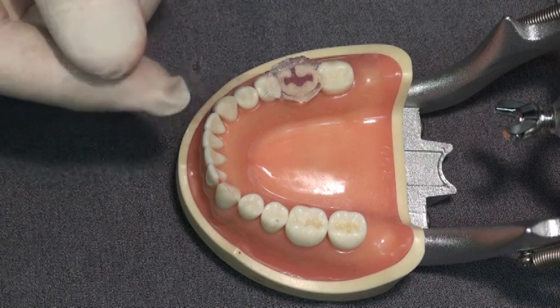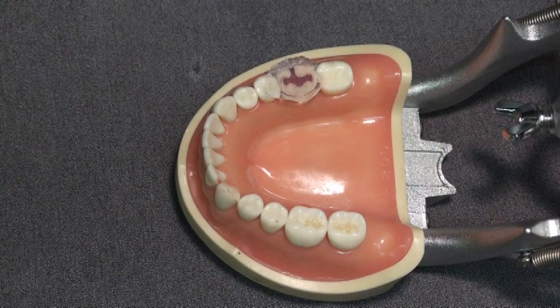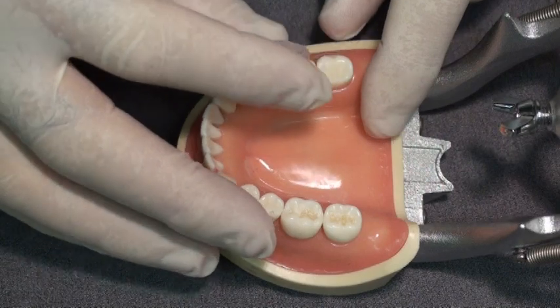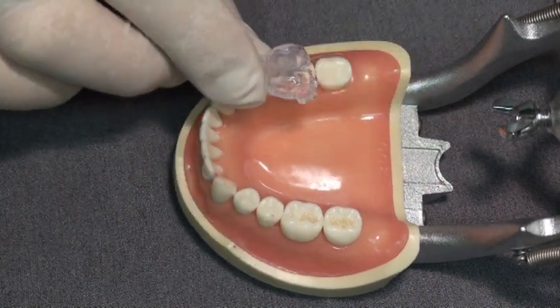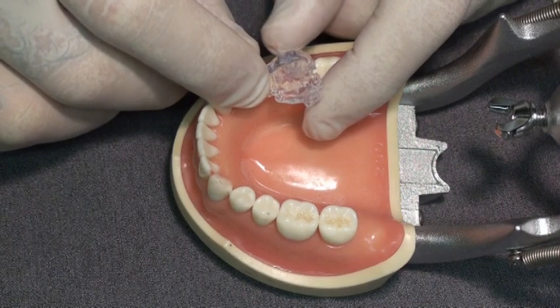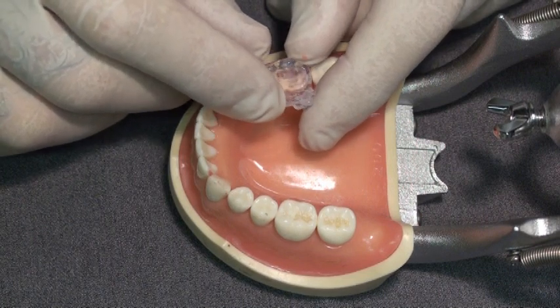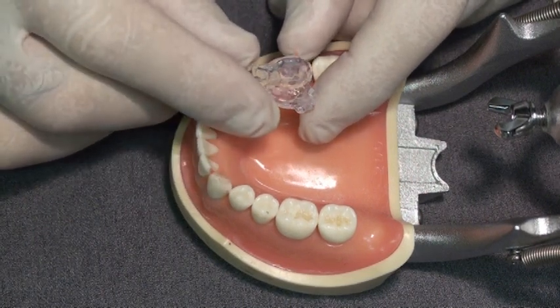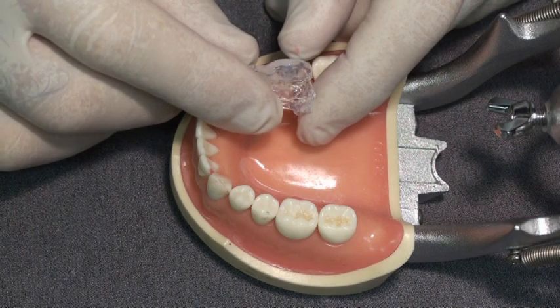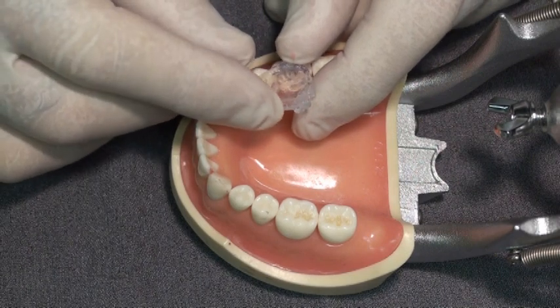The Mylar strip comes right off, leaving a very smooth, flat surface. The impression comes right off because it's just a polyvinyl siloxane impression. It's very hard to see the detail in something like this being a clear impression. But we'll use this clear impression to reform the unset composite later on in the procedure to create a surface that needs minimal shaping, finishing, polishing, or adjusting.